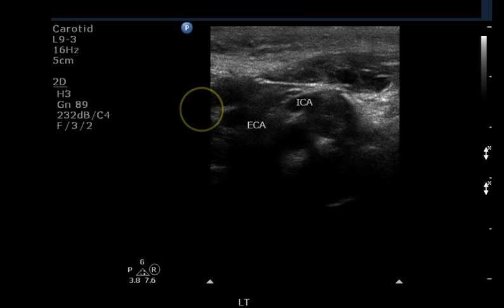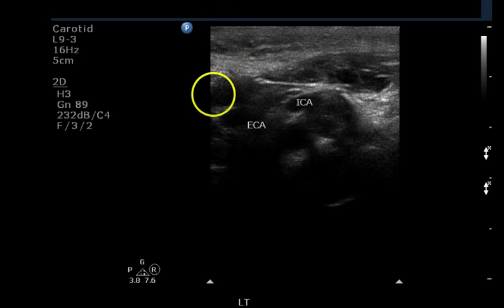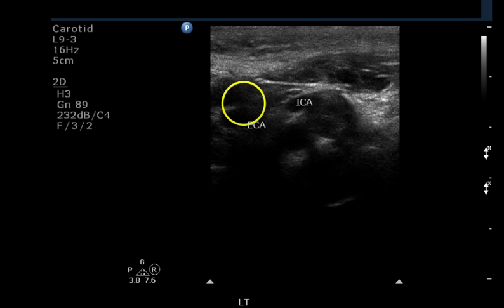On this patient we have high-grade stenosis in both internal carotid arteries. On both sides the stenosis is greater than 70%. We have normal flow in the external carotid arteries, normal flow in the subclavian arteries, and antegrade normal flow in the vertebral arteries.